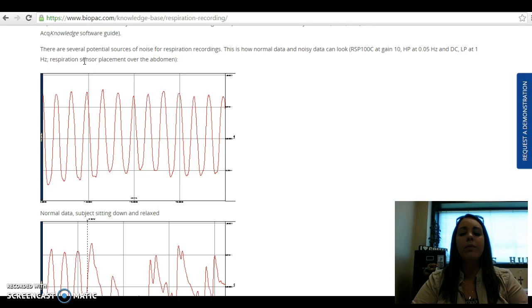So for this, if we were to just breathe normally as such, didn't that feel nice? Okay, you can see here the rising and falling with inspiration and expiration. Notice the intervals between breaths.